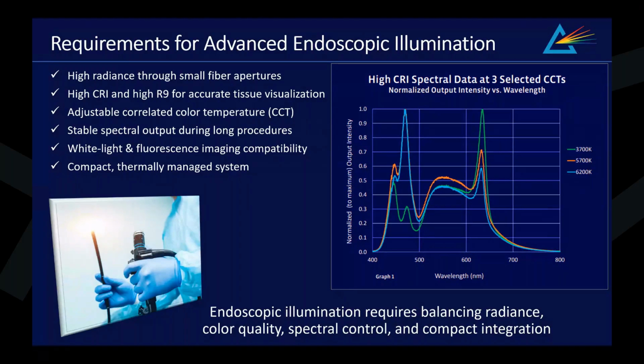One challenge is delivering high radiance through relatively small fiber apertures while maintaining efficient optical coupling and uniform illumination at the surgical field. Color quality is also particularly important in surgical imaging because subtle differences in tissue appearance, blood perfusion, and anatomical contrast may influence clinical interpretation during procedures.